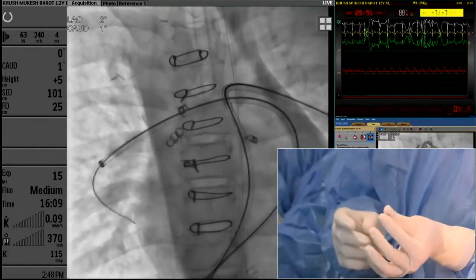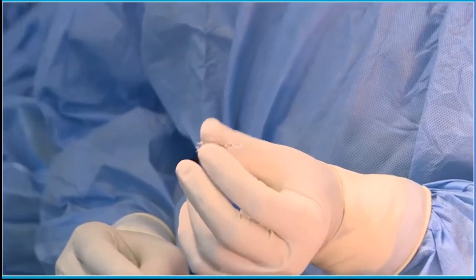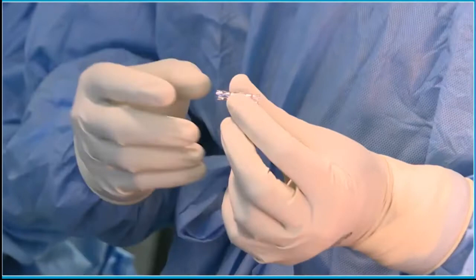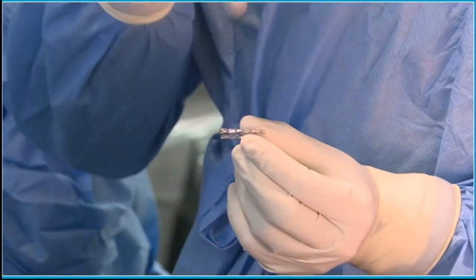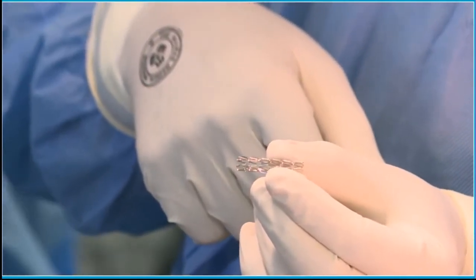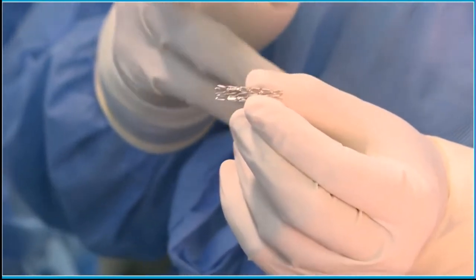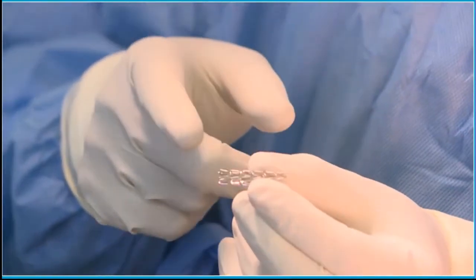Now this stent has certain peculiarities. It's a cobalt chromium stent. You can put a patient on MRI with this. It has a C and S link. Completely zoom in. Okay, we will show you in one of the lectures. Dr. Avinash from JIPMER Pondicherry is going to give a lecture on this particular stent in another couple of days in the What is New session.